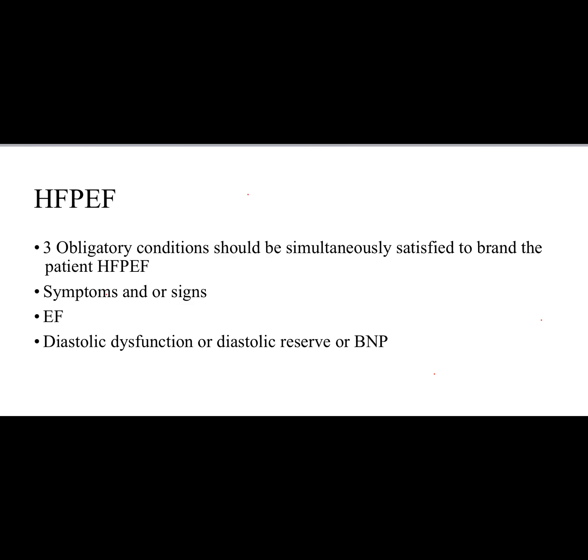Somehow, either during the echo basal condition, the patient comes and I do the echo and I find it. If I don't find it, I will try my best to unmask it. How can I unmask it?